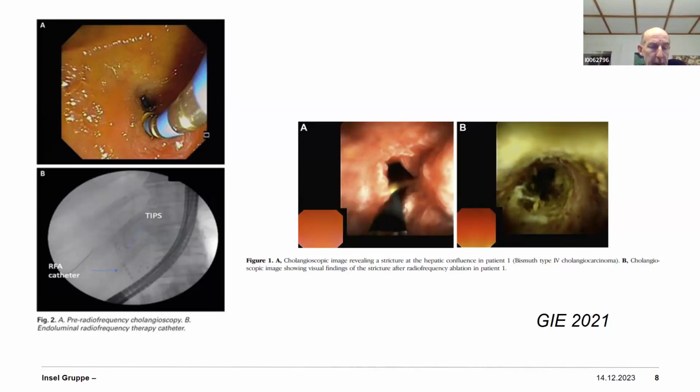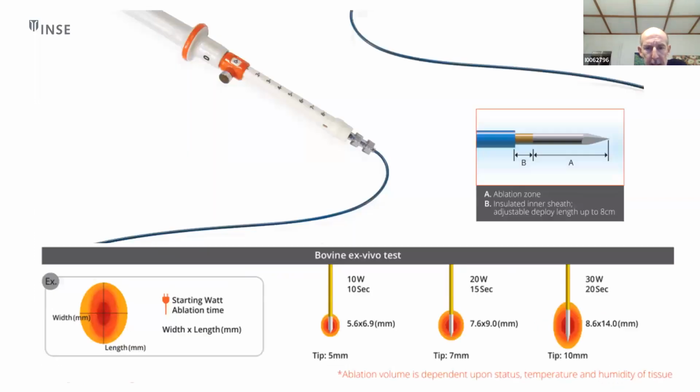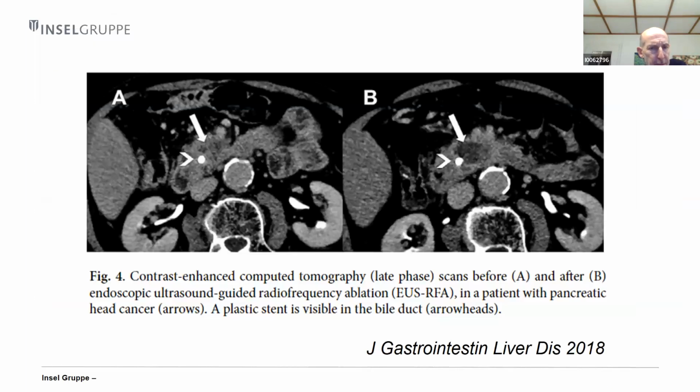Ja, Riad, vielen Dank für die schöne Präsentation und diesen Überblick. Sicher gut, dass wir das auch in unserem Zentrum anbieten können. Von meiner Seite am interessantesten sind natürlich die Läsionen im Processus uncinatus. Da haben wir eine gewisse Distanz zu den Gefäßen, und chirurgisch sind die schwierig, weil das Pankreas fast nie gestaut ist. Jetzt zu den Zysten vielleicht noch eine Frage.